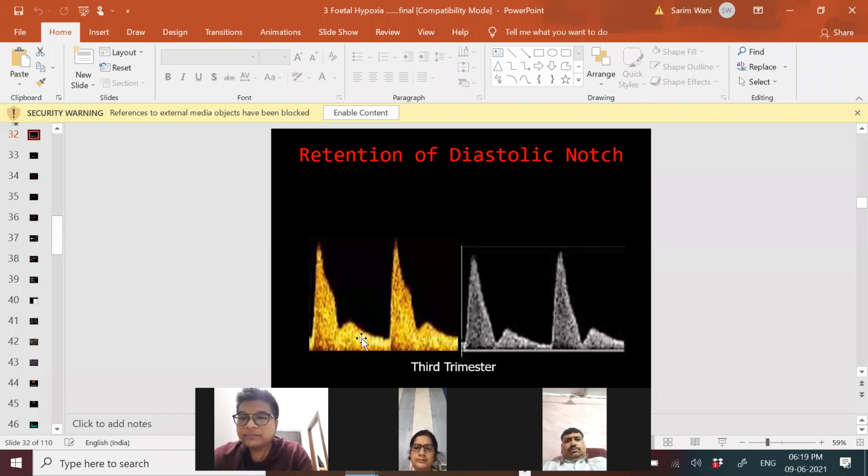Yes, sir. Now, coming back to the question, what will you expect in a uterine artery of an infertile patient, Dr. Sandhya? So, low diastolic flow or high diastolic flow? Low diastolic flow, sir. Very good. Now see, you know it, but my job is to convey the simple thing: these S by D ratios, how to shake your neurons.